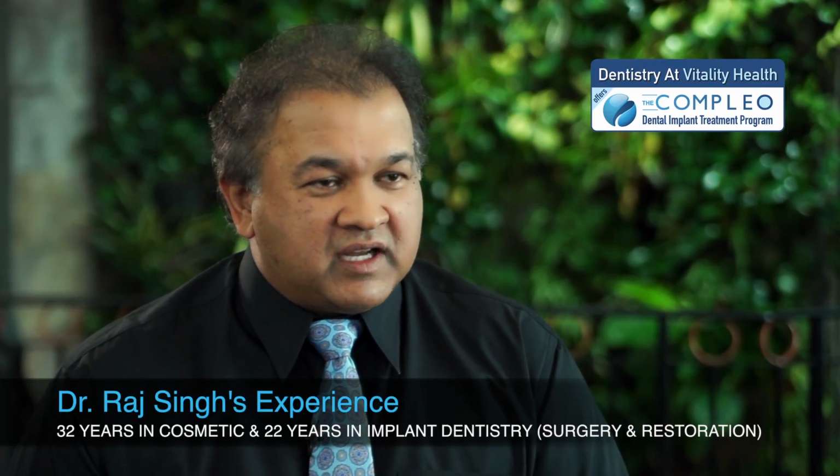Conventional implants are the way we've always done it for the last 40, 50 years. And that involves cutting the gum tissue, opening it up, peeling the gum tissue back enough to be able to locate the bone, and then visually lining that implant up and placing it within the bone to try to avoid any of the vital structures that might be around there.